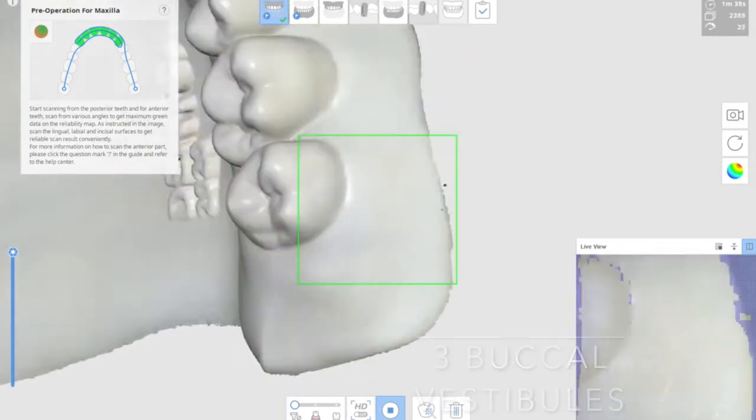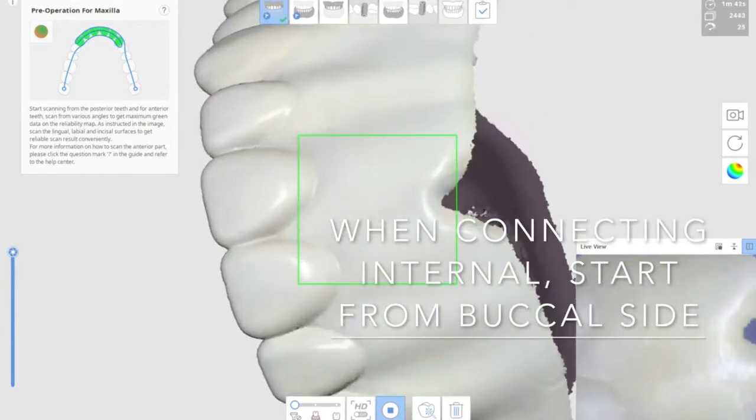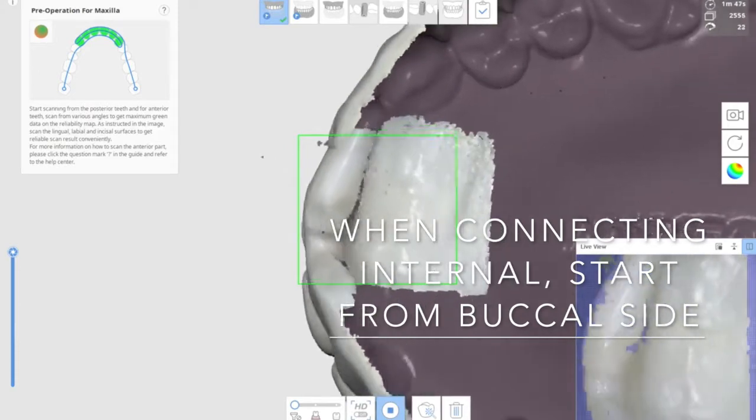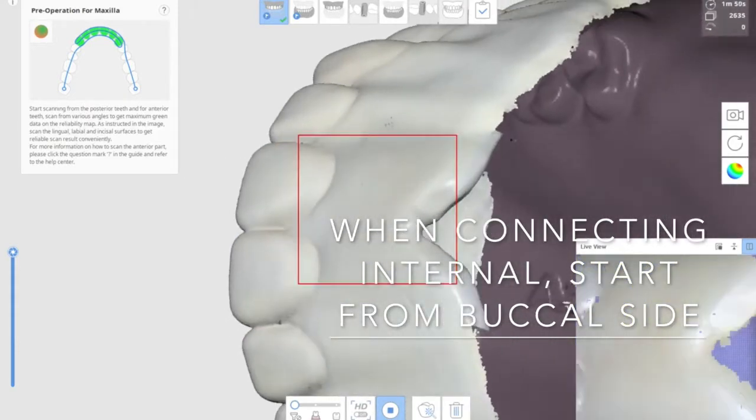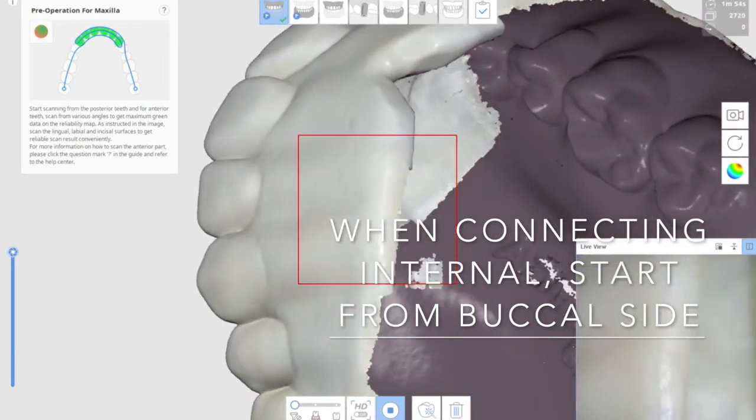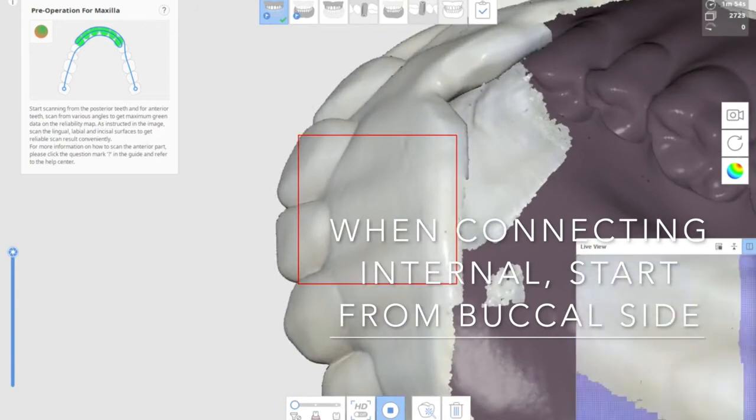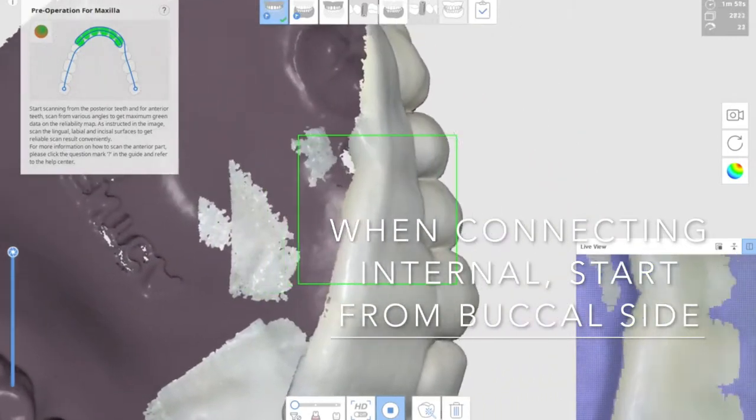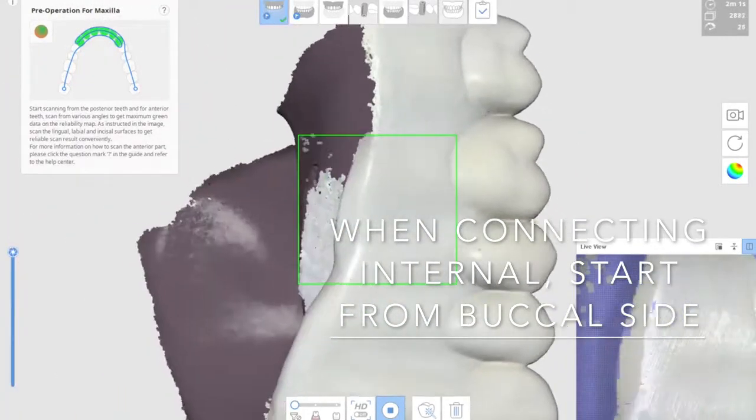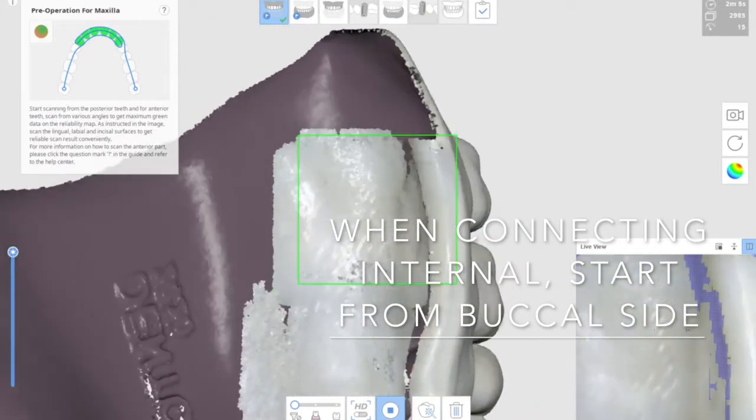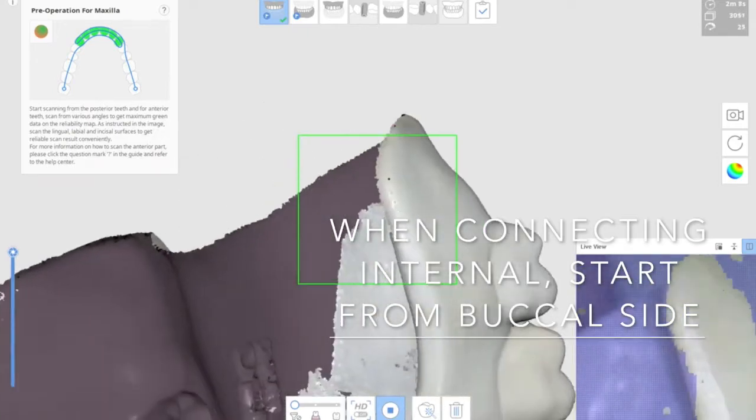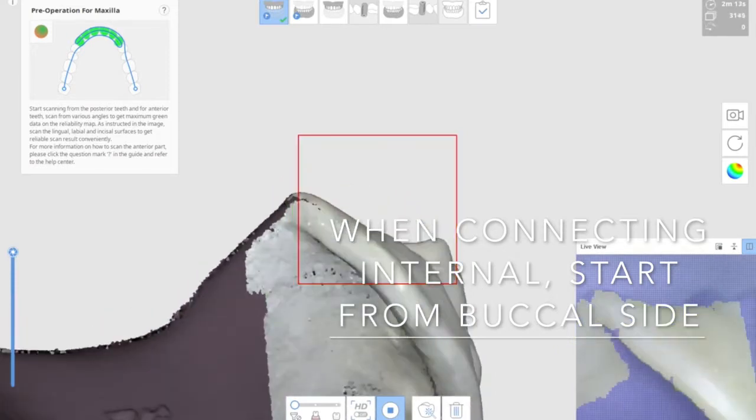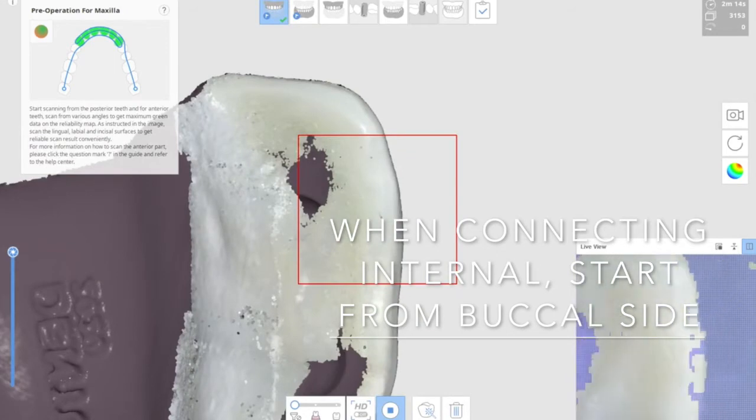Once you complete that one, now we need to scan the internal surface. When you're connecting internal surface, start from the buccal side so that the computer understands where you are holding. Doing it that way, you are not making any error. As you see here, I start from the buccal side, rotate the tip, go into the vestibule border and the internal. Cover from the teeth, starting from the teeth, rotate it around the border and the internal. Now doing this, you are eliminating mis-fitting of newly scanned picture onto the existing.